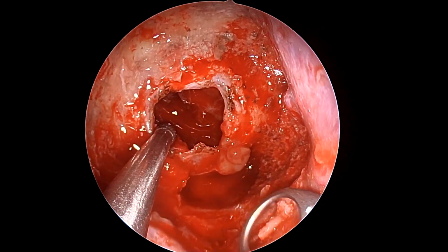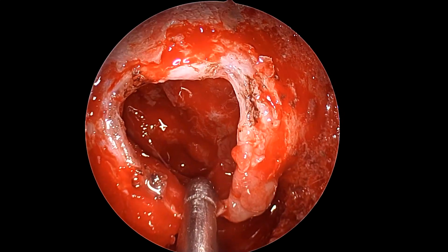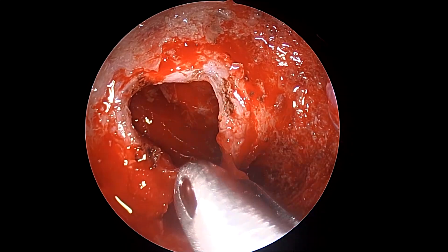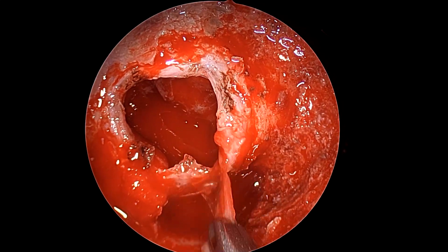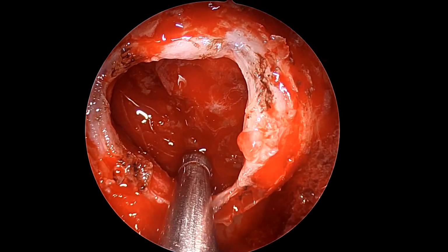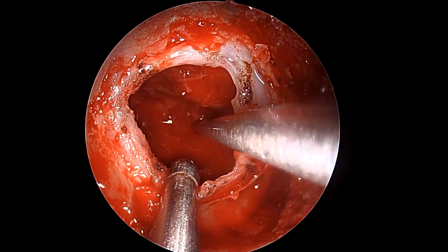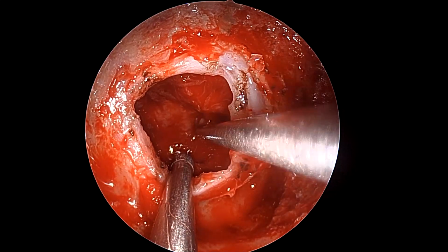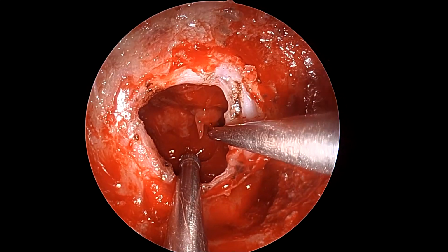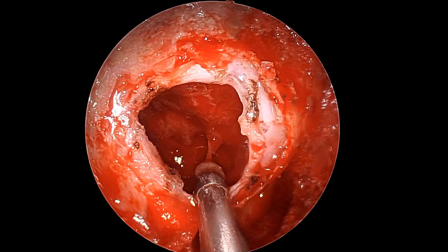Now, after a little while, once the central part of the tumor has been removed, one obviously cannot access the lateral part without using either an even larger exposure, or an angled endoscope and angled instruments to curette out the parts of the tumor that are more towards the angles laterally, especially on the right side, as compared to just moving in the center. So after a while, it becomes important either to extend the incision and visualize more laterally, or to use an angled endoscope inside the sellar cavity to be able to access the lateral part.